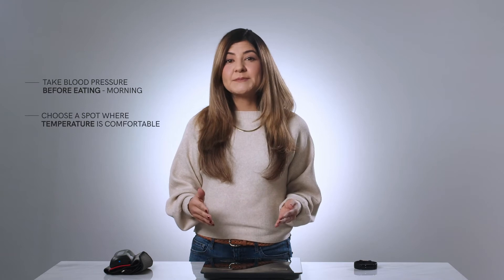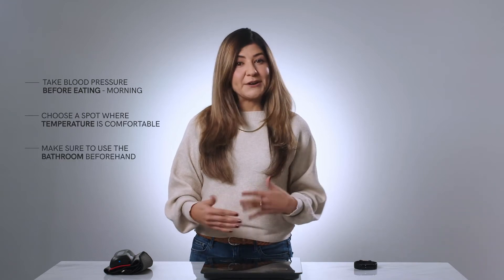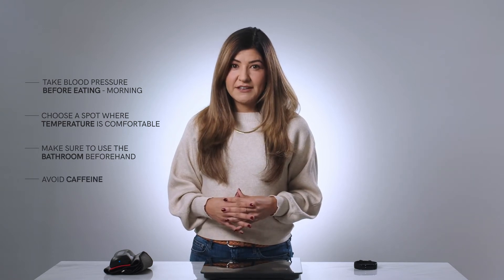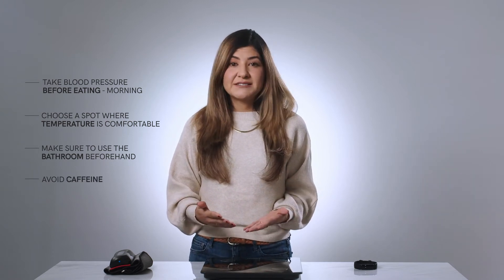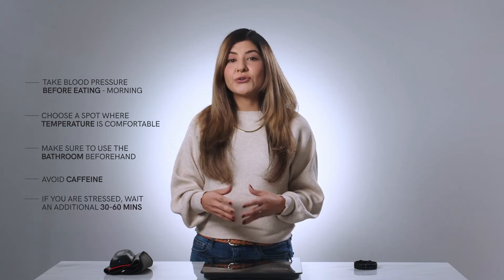Choose a spot where the temperature is comfortable. Be sure to use the bathroom first so your bladder is not full, and avoid having caffeine just before taking a reading. Try to sit quietly for five minutes. If you feel stressed or notice that your heart rate is high, wait an additional 30 to 60 minutes.